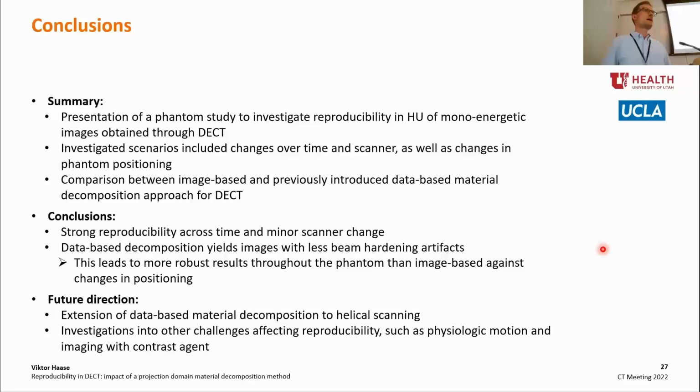Yeah. I know from other experiments that we did that you have changes in our scatter parameters when you have a larger object, or also when you change that. But I did not look here for this experimental setup how exactly that is changing.